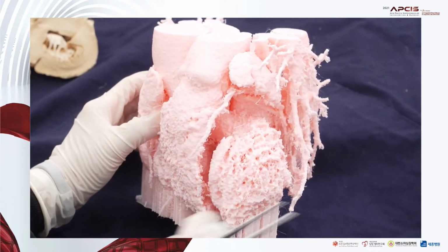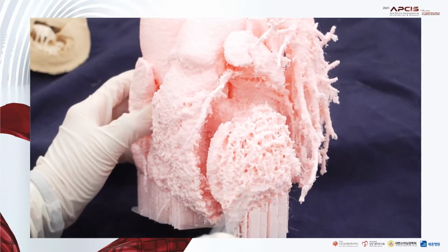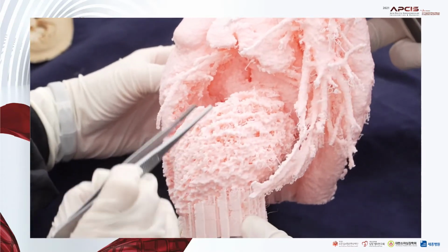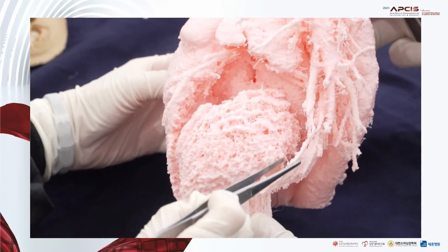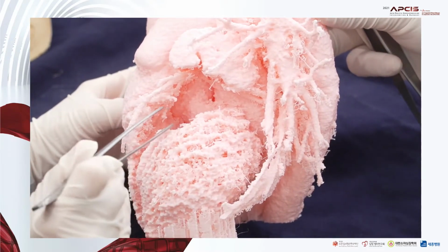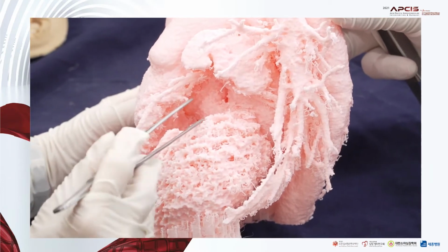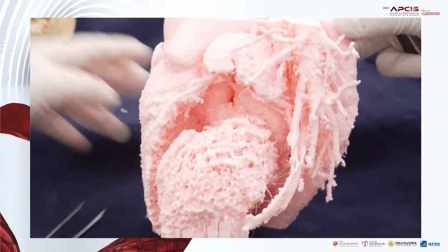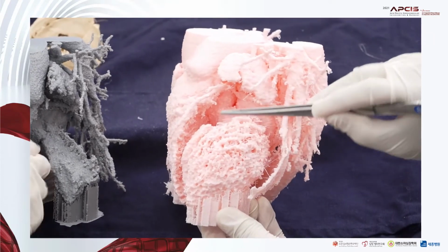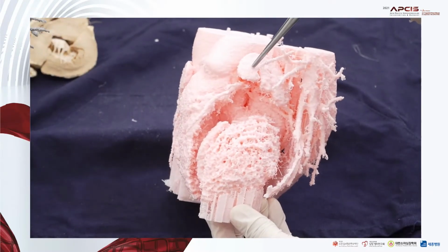in this specimen, we cannot see the myocardium itself, but here is the left anterior descending coronary, and this is the left ventricular lumen. So we can estimate the left ventricular myocardium. When you see this part, its thickness is like this, but as Dr. Sa already mentioned, the anterior, basal part of the left ventricular myocardium is thickened like this. And also we can see the aortic root. The aortic valve is of this size, and this is where the mitral anterior leaflet is. And the left atrial appendage and subpulmonary outflow.